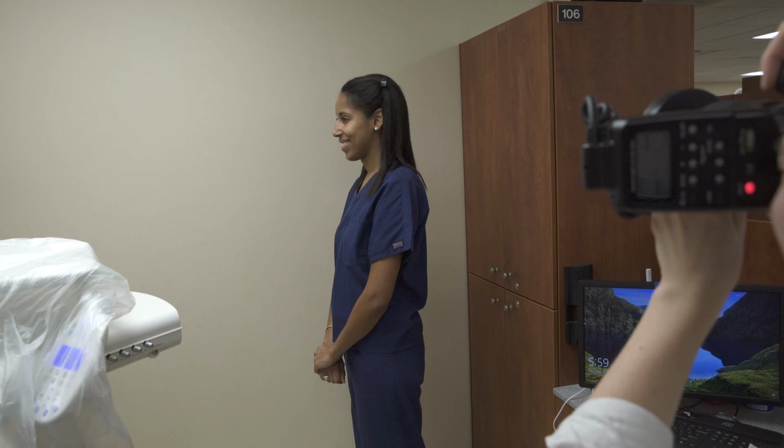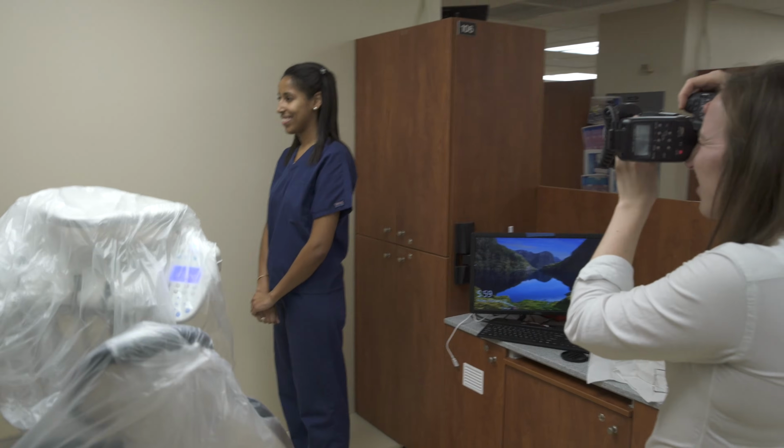Frame the face so that the top of the head is the most superior part of the frame, and you just capture the tip of the nose. How much of the back of the head you get depends on the patient's head shape and is not important for the photograph. To position the patient, have her turn her head towards the wall and slowly move towards the camera until you see either the first hairs of the opposite eyebrow, the tips of the eyelashes, or the opposite side of the philtrum. Then shoot your photograph.